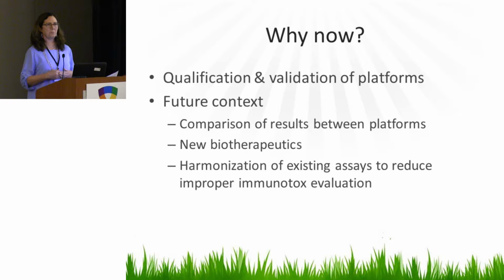So we would be able to compare standards within a company and see whether they perform in the same way, but we'd also be able to compare our data with historical information and develop some knowledge. And, you know, as much as it's not really possible to harmonize the assays, this gives us an opportunity to have some consistency across assay platforms by having everybody use the same controls.